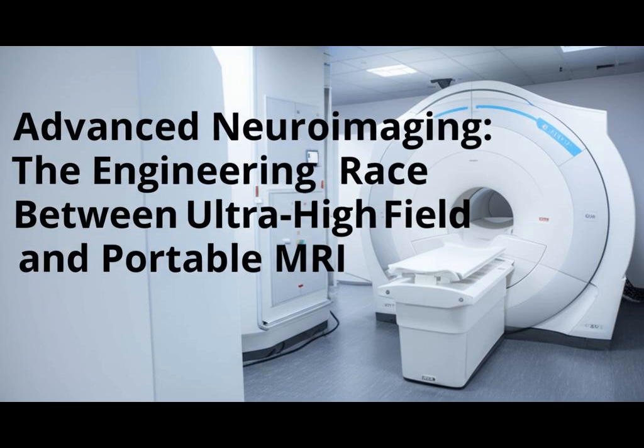First, let's look at ultra-high field, or UHF MRI. These systems operate at magnetic field strengths of 7 Tesla and above, much higher than the standard 1.5 or 3 Tesla scanners found in most hospitals. Why go so high? The main goal is a massive boost in signal quality. This extra signal allows for images with sub-millimeter resolution, letting scientists and doctors see tiny brain structures like cortical layers, parts of the hippocampus, or minuscule blood vessels.